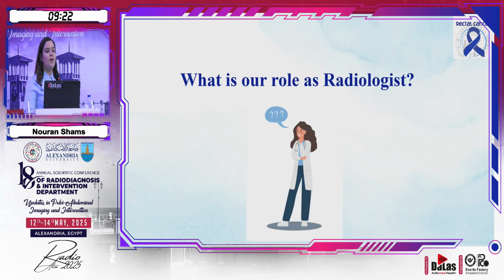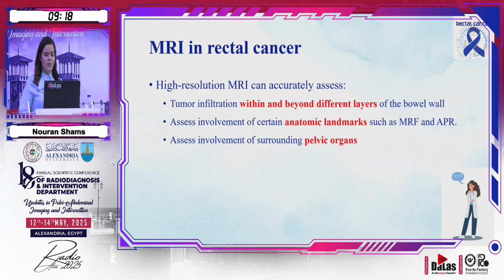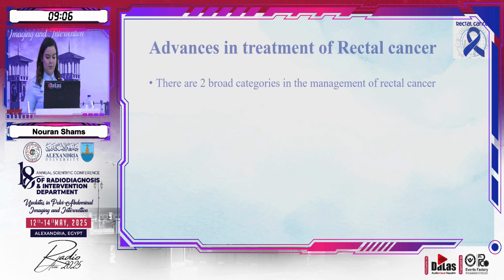So, what is our contribution as radiologists? Thanks to high-resolution MRI, we can assess tumor infiltration within the wall of the bowel, assess important anatomical landmarks that affect surgical techniques and invasion into surrounding pelvic organs. To appreciate and understand our role, let us touch the outline of management of rectal cancer.